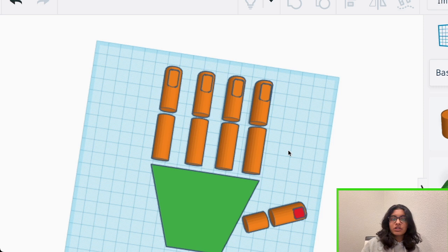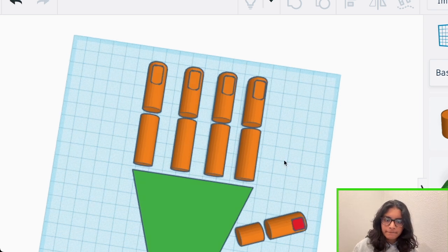Alright, with all of your fingers shaped and all of your middle joints placed, the last thing you might want to do is add some differences between your fingers, right? So the index and the ring finger are generally the same size, but your middle finger will be a little bit taller, your pinky finger will be a little bit shorter, and your thumb will be a little bit wider. So just add these changes through the dimensions that you just changed to add a little bit more realism to your hand.